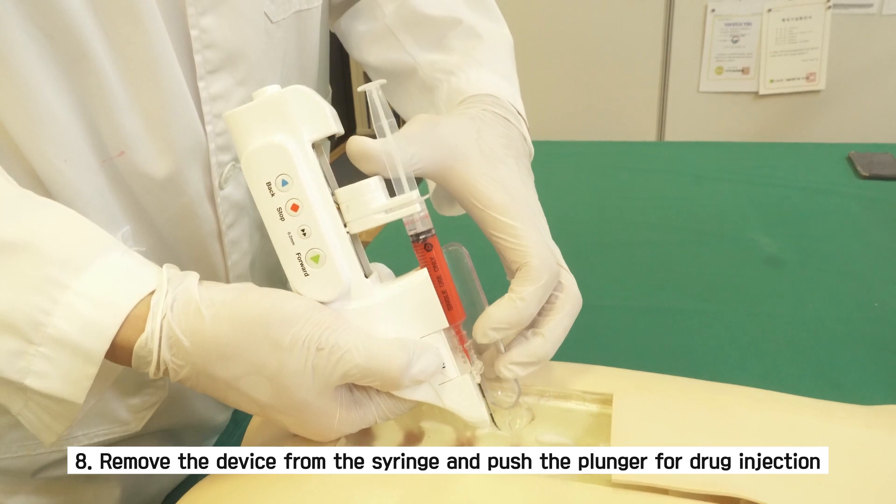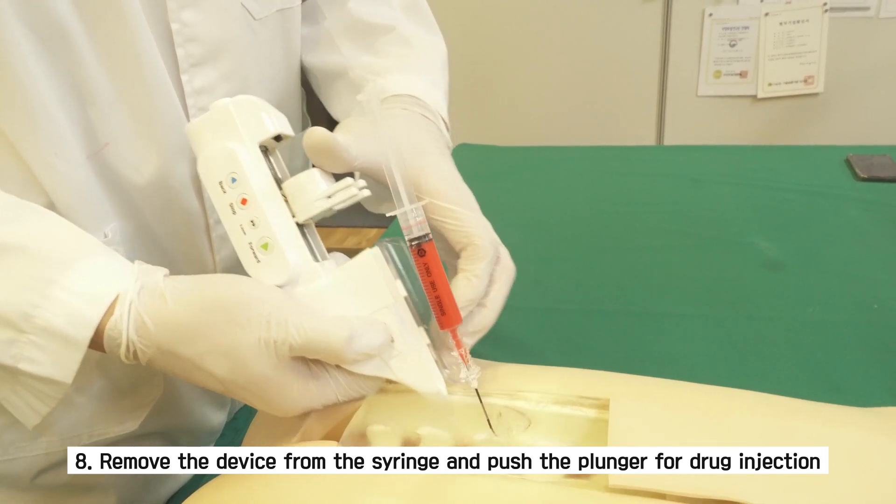Eighth, remove the device from the syringe and push the plunger for drug injection.